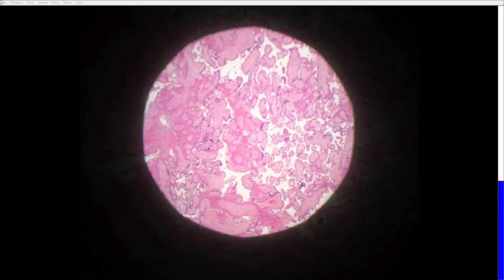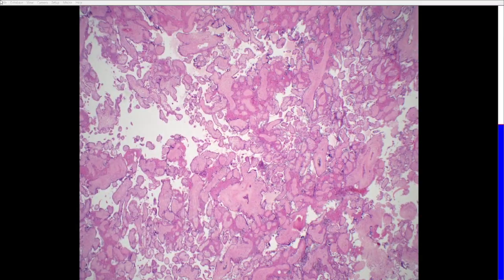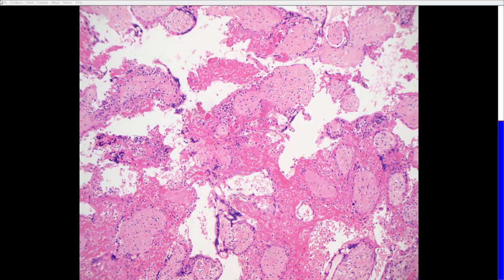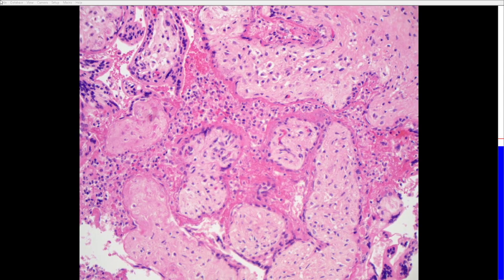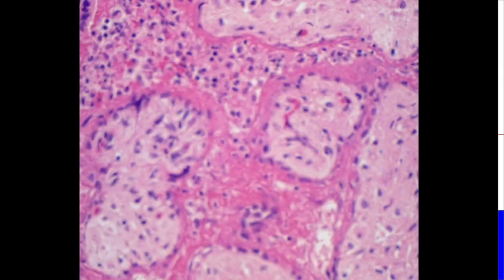And then finally, chronic histiocytic intervillositis. I don't actually have a POC with that. I only have a mature placenta with that condition, but that will give you a sense of how it looks like if this was a POC. But again, in POC it would be a similar kind of picture. What you would see is in between the villi, increased perivillous fibrin as in the other condition we discussed, but in addition to that, a lot of histiocytes, collections of histiocytes. So that's what we see here.